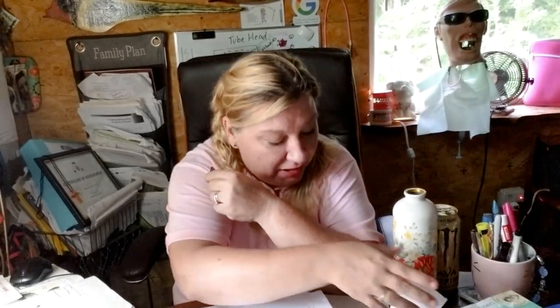So if I had two films right now and they overlapped and they went through the processing and the rollers and everything, you're going to have to peel it off. Just like a piece of paper I mentioned before, you leave a piece of paper on the desk, it gets wet from your coffee, and then you try to take the piece of paper up, and it's stuck there. Same with this, okay? Remember that.